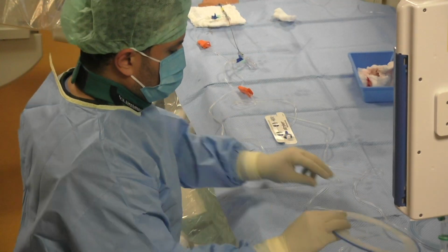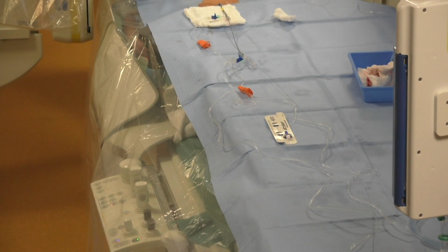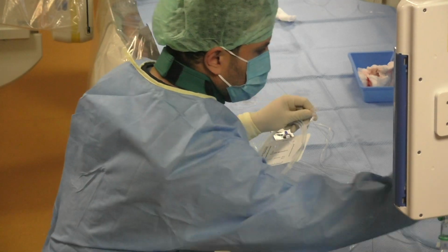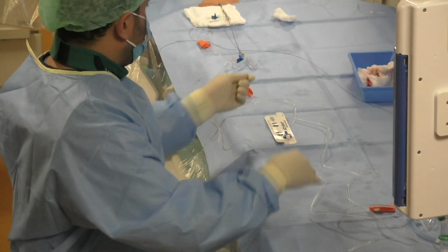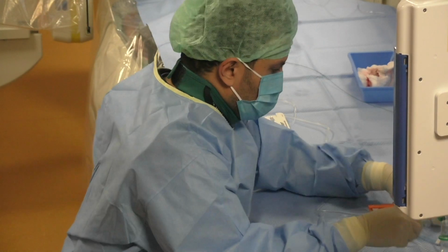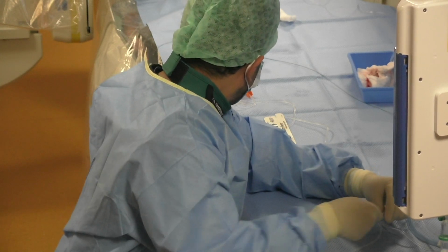And we have here another very hard curve. That's why we will pass it with the microcatheter and microwire. Here we're preparing the microcatheter with the microwire. We're pushing the microwire into the microcatheter.